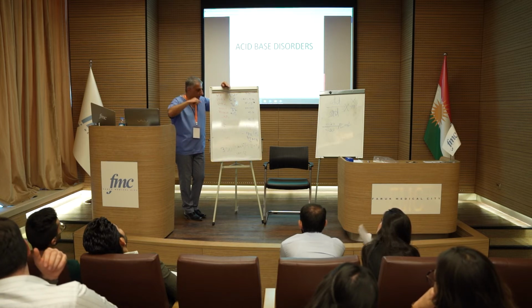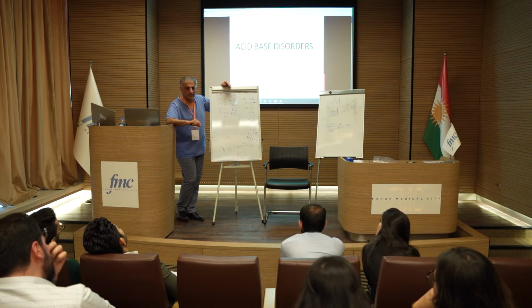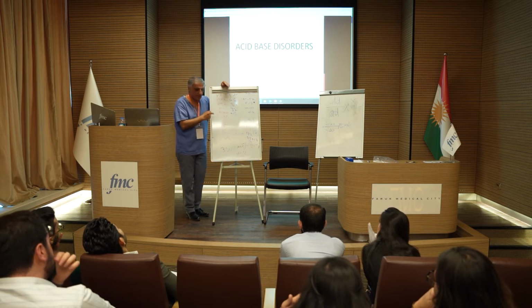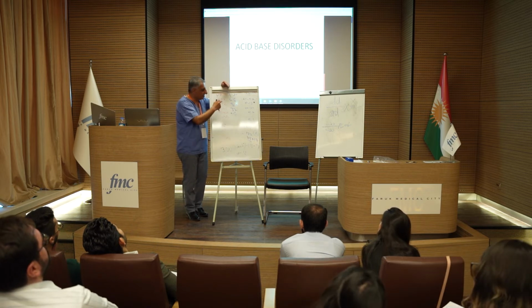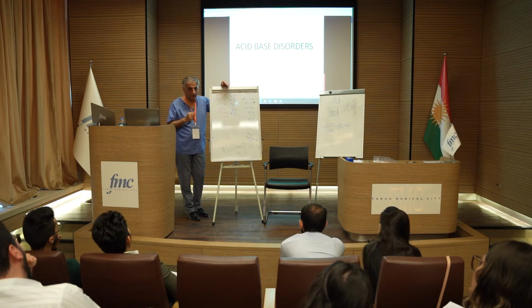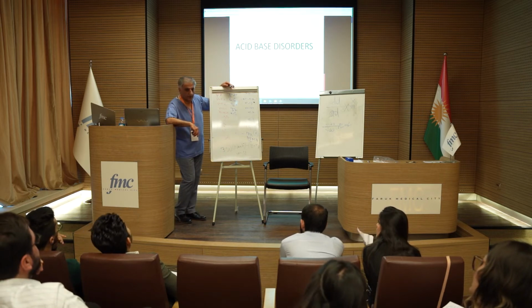So before you go to bicarb, where is the acid coming from? Respiratory acid. But there's some compensation happening, not achieving much. So this is a respiratory acidosis, partially compensated respiratory acidosis.